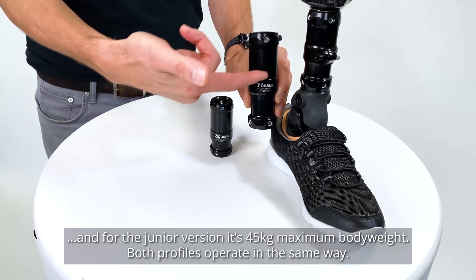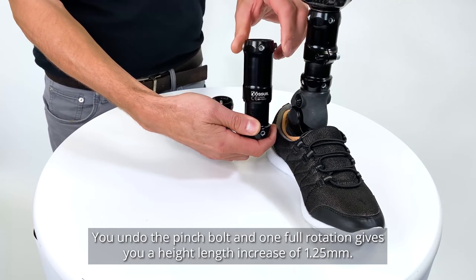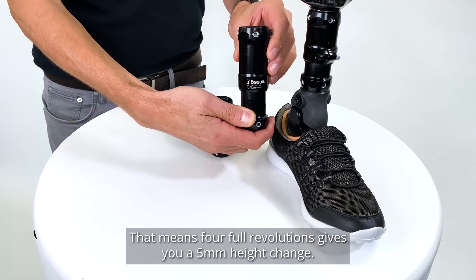Both profiles operate in the same way. You undo the pinch bolt, and one full rotation gives you a height length increase of 1.25mm. That means four full revolutions gives you a 5mm height change.